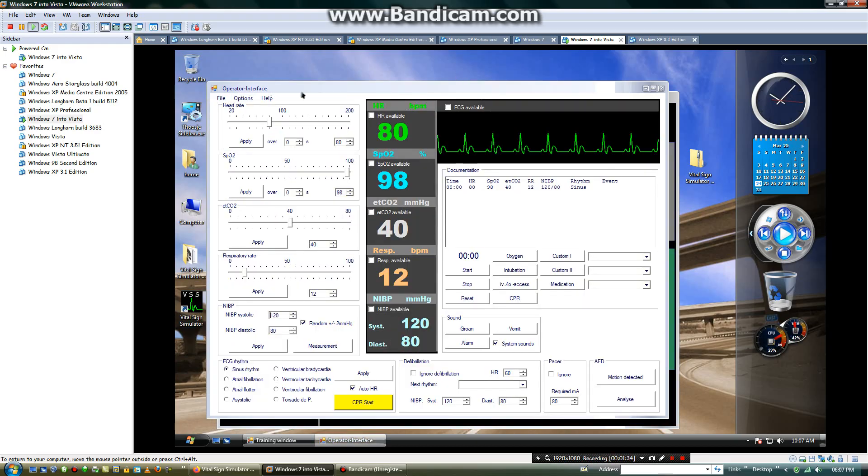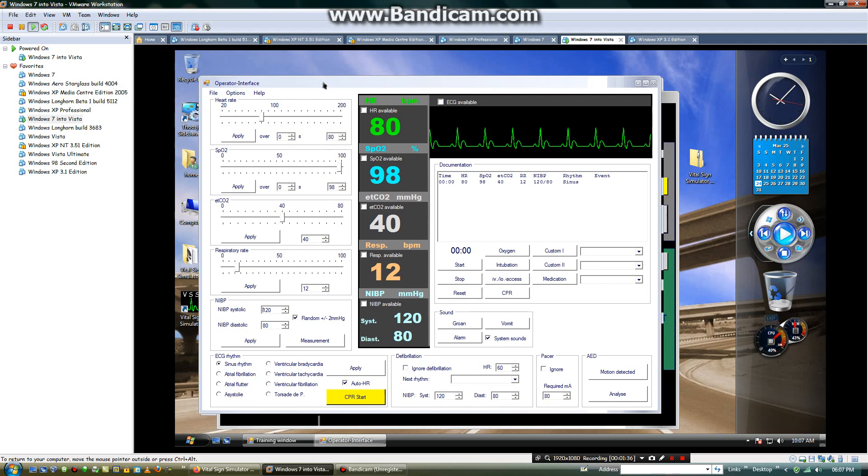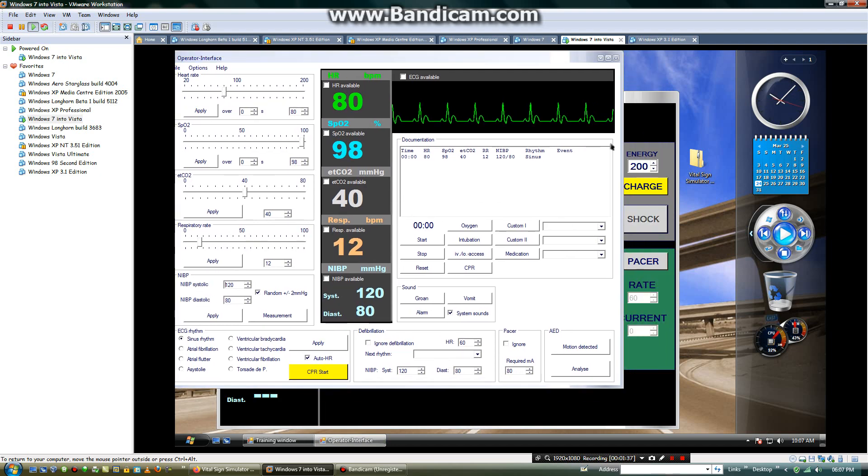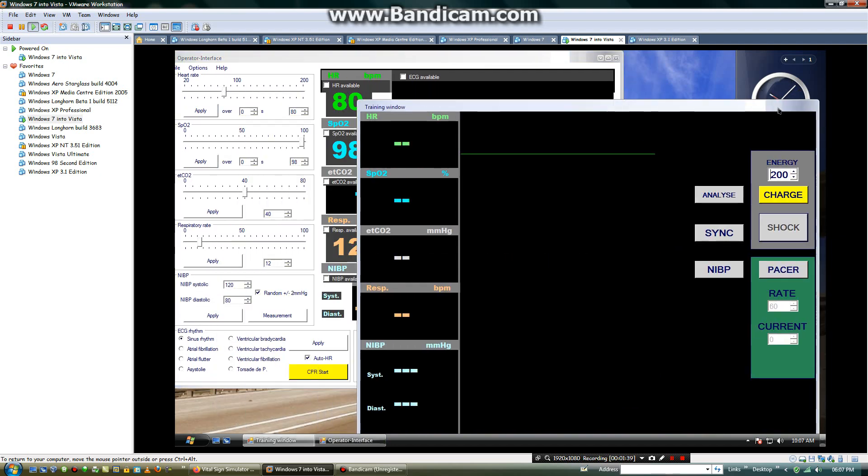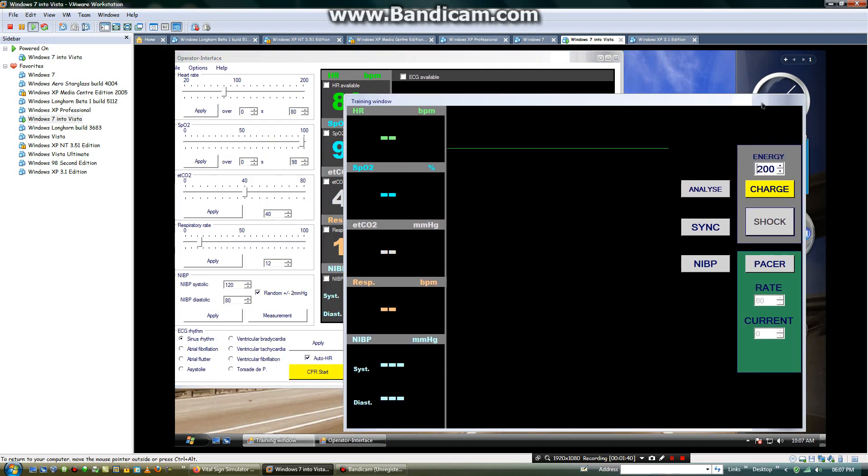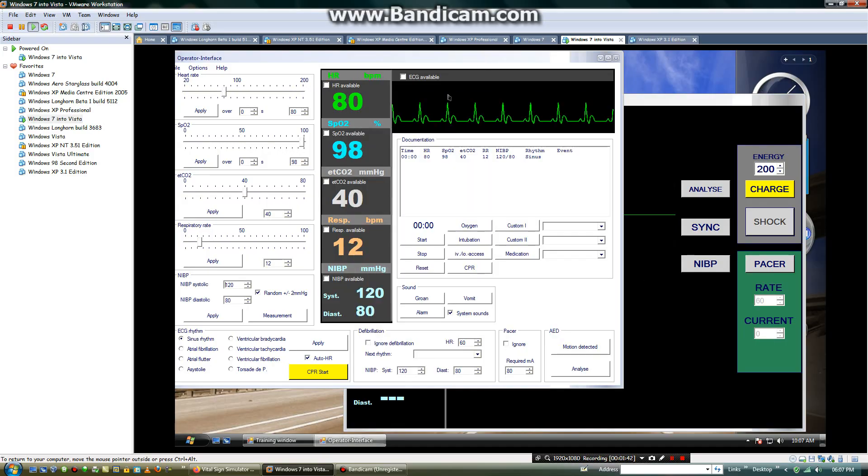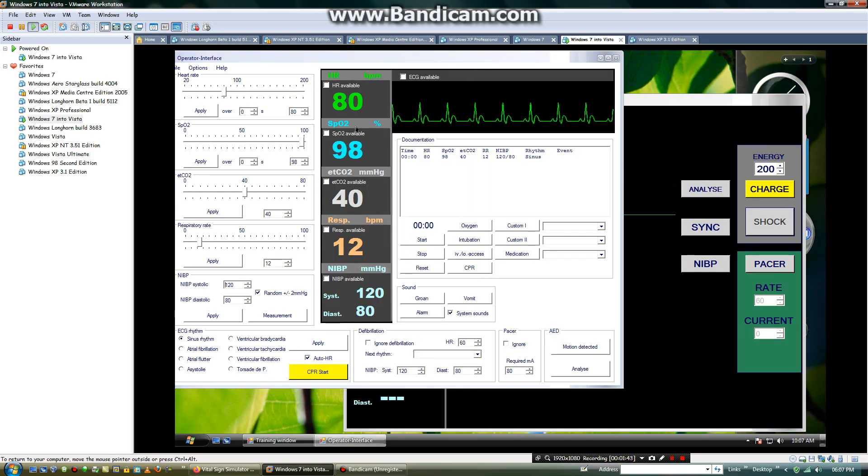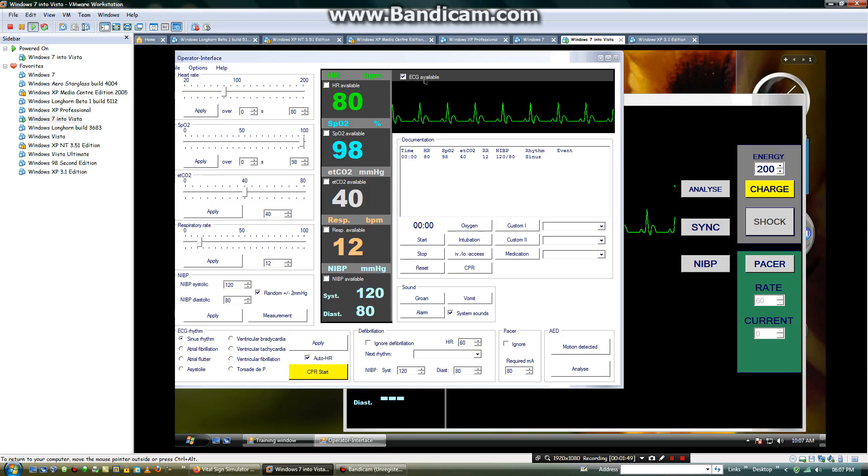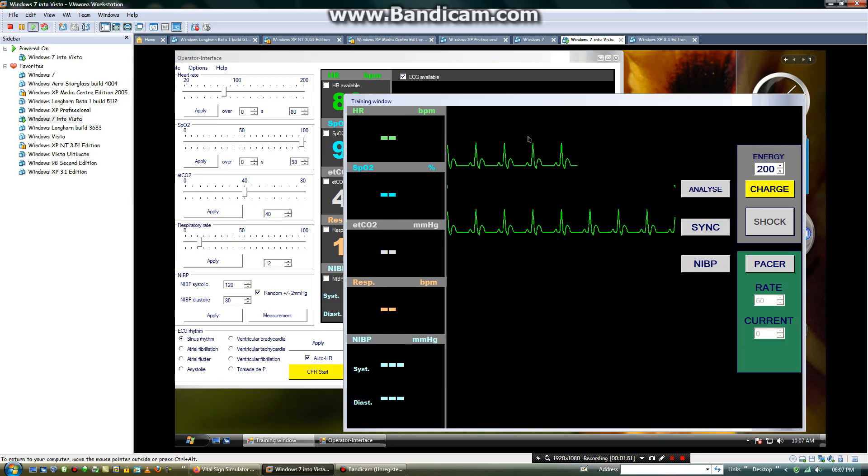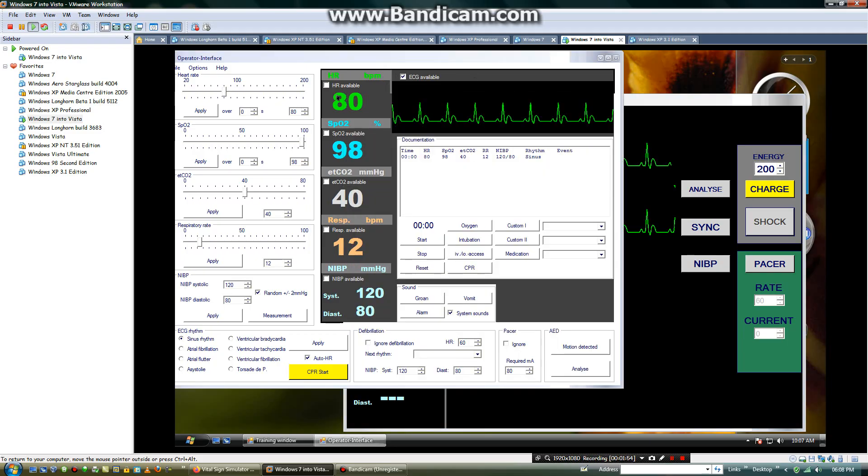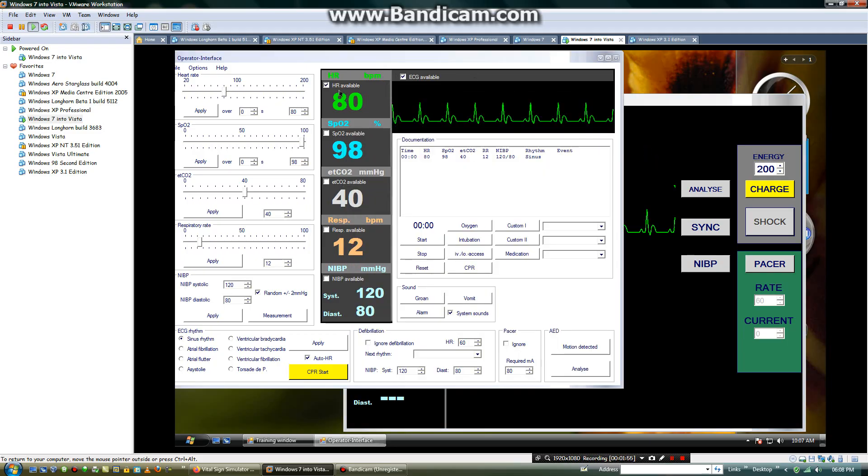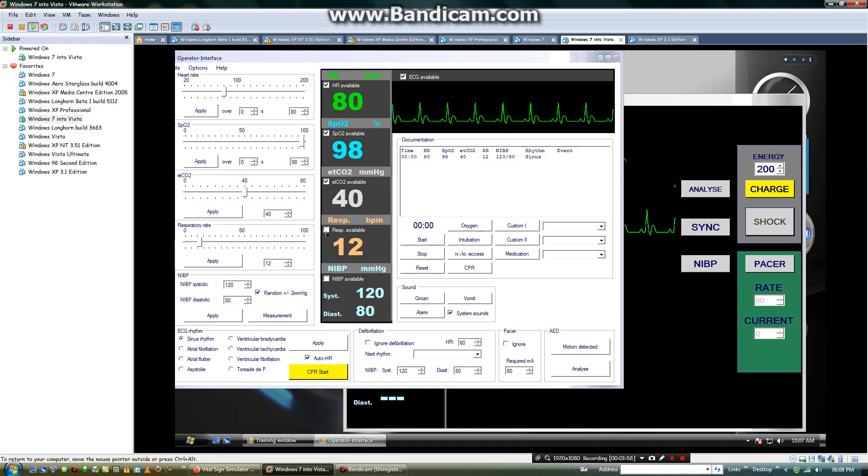Now this is the operator interface. And this is the training window. Now you can adjust the heart rate. You will change the ECG. You will check mark ECG available. Then you will show the ECG interface. You will activate all of the patient monitoring parameters.